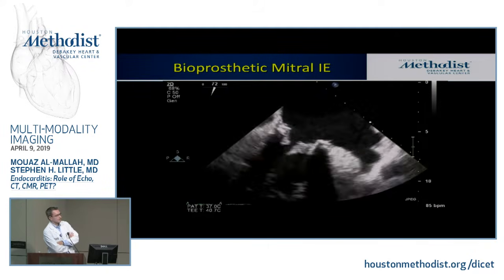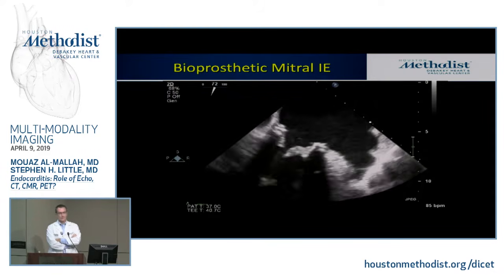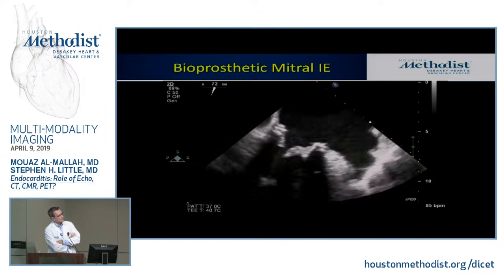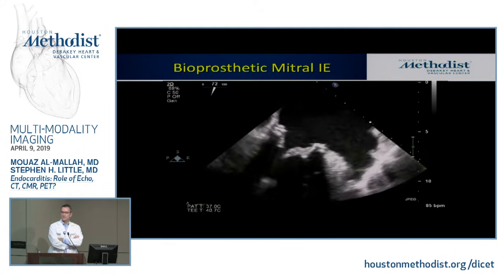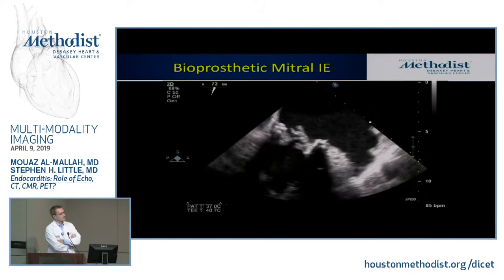So unlike a mechanical valve, in the bioprosthetic you do. So this shows that. This is a very weird looking bioprosthetic valve. The posts and the sew ring actually look okay. This was a patient with very high surgical risk, so a very low appetite to take him back to the OR, recognizing that this is almost impossible to sterilize, but almost a palliative approach.